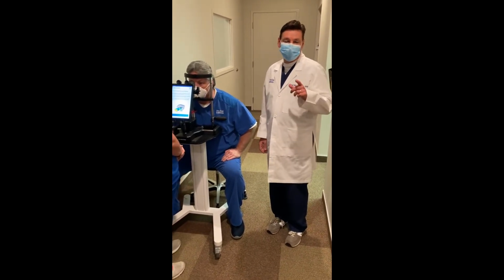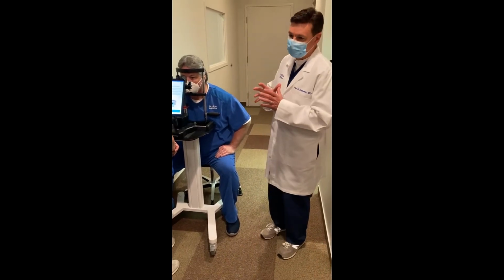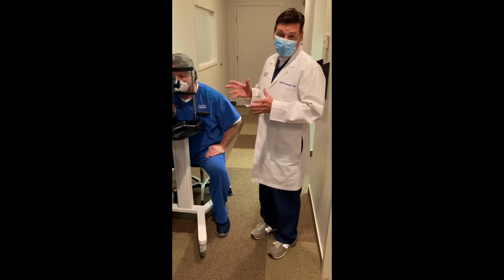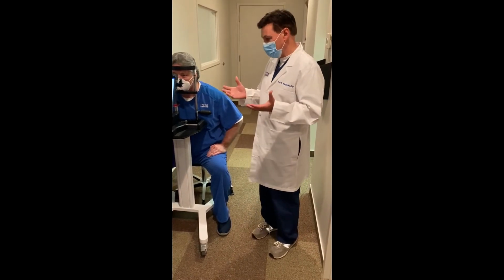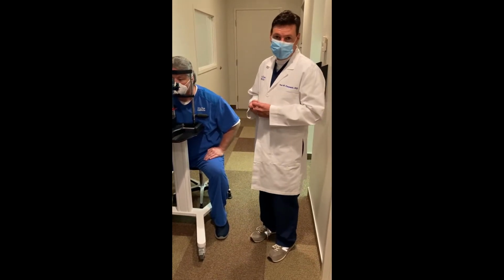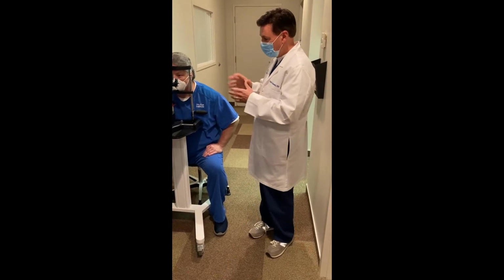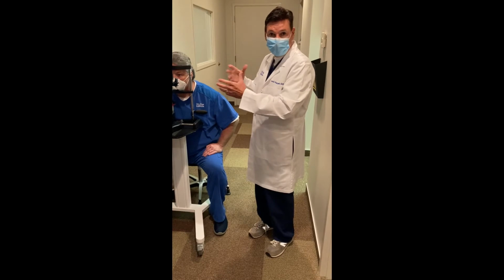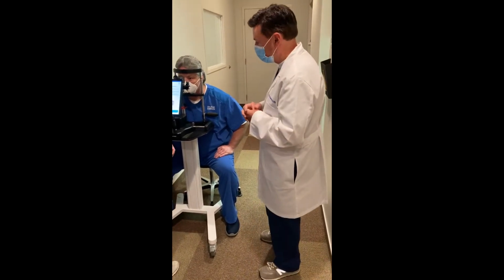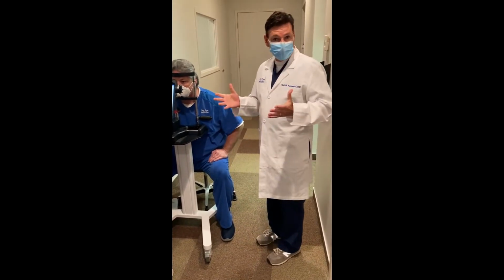Today I'm going to take you through a technology I'm extremely excited about known as the MuCheck. It's a wonderful meibography system that's very simple, but also a great patient education tool. Beyond that, it takes into account the data, allows us to do a symptom score on the OSDI-6, which gives us a lot of the key symptoms related to dry eye, and allows me then to take it and educate the patient, give us a grading of where they're at based on the Pult score. That's a Meibo Scale, as is listed here, but Dr. Pult has done a lot of the work in terms of creating this and validating it, and so we're lucky to get to present this to you today.